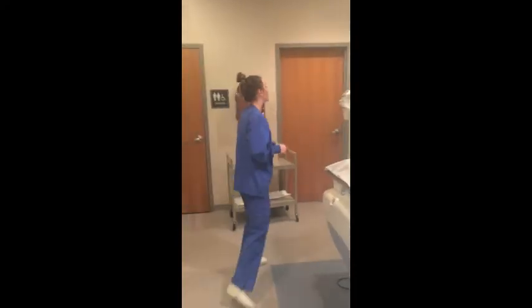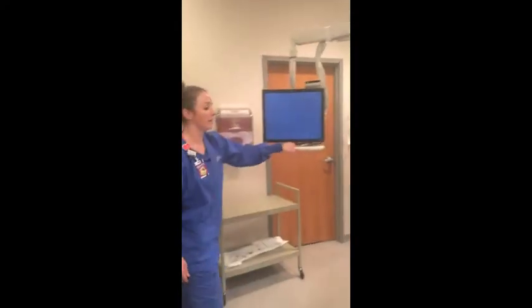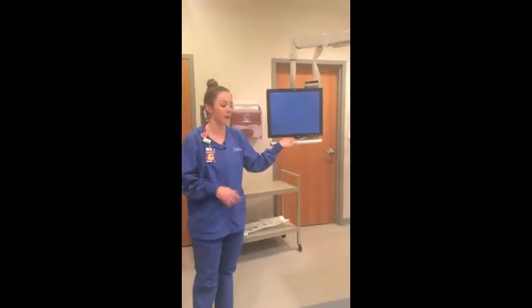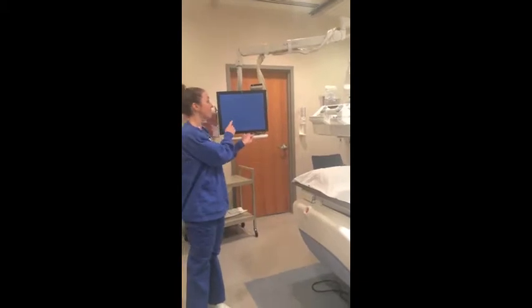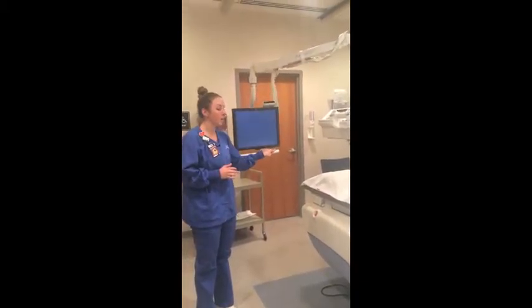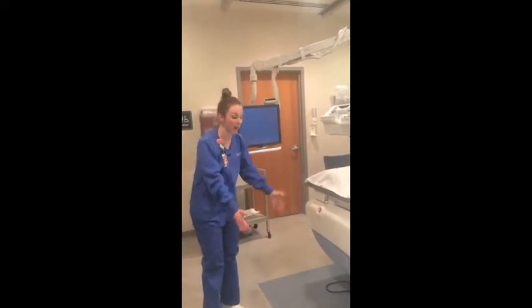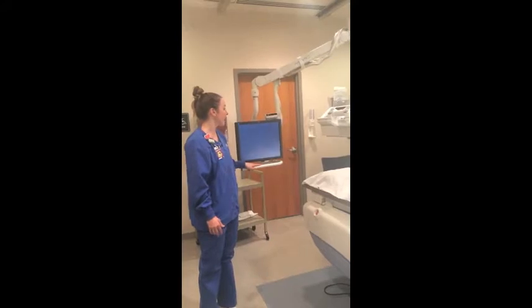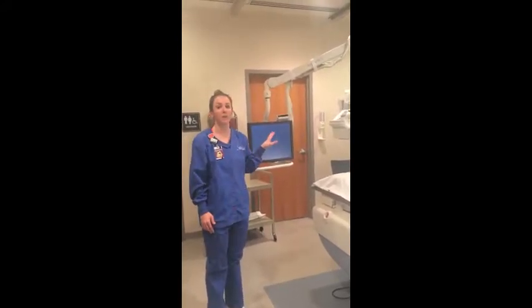But the last thing I want you to focus on is the screen itself. When the radiologist is doing the procedure, they'll be stepping on the dead man switch, and they'll be looking at this TV screen. So it's really important for you to put it in a way so that the radiologist can take a look at it. Dr. Moore likes to sit on an actual stool, so you'll bring it down and kind of face it towards him. But this is what's going to show the live movie feed.